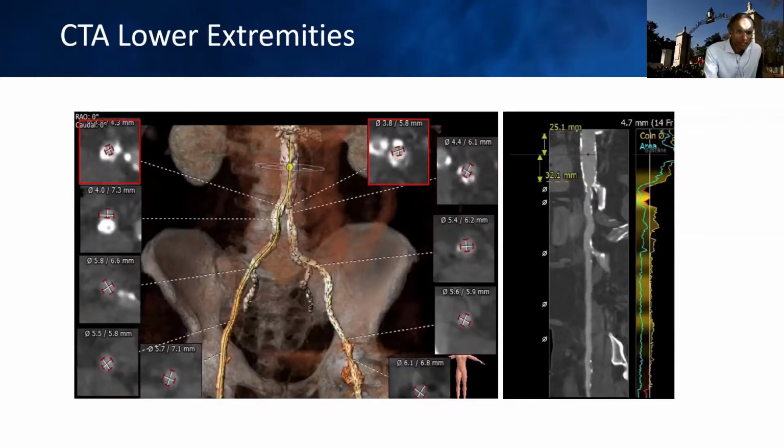It's not seen here. There's actually some additional calcium lower down in the external iliac transition from the common iliac artery. So in this case, between both, we felt that we may have a better chance of advancing the valve on the right side, but in performing lithotripsy at the bifurcation, there was some concern in potentially jailing the contralateral iliac artery because of the nature of calcium deposition and lesion deposition right at the bifurcation.